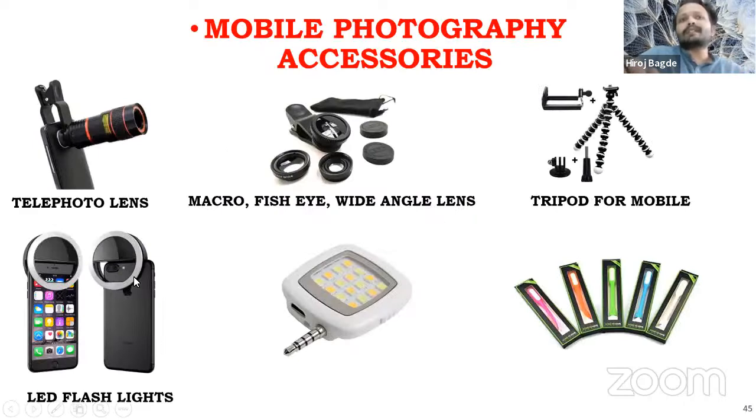We have LED flash systems. Can you see this? This is the ring which we talked about yesterday. This is the ring flash. This is called the selfie ring. Selfie rings are available in the market at very cheap cost. These can be manipulated with power also.